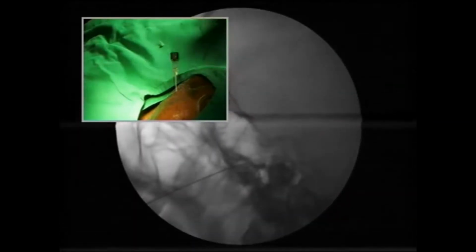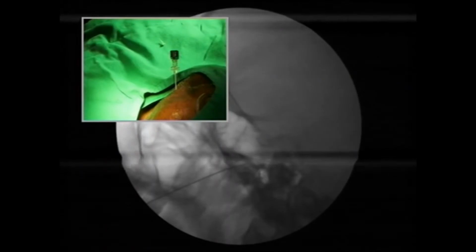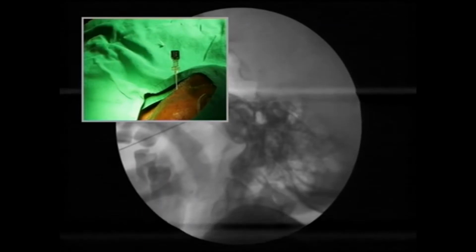Okay, can you get the C down? Okay, thoda. Okay, sure. Okay, stop. Can you give me a marker again? Okay, can you focus on the C? Please come out. Focus on the C. I want to explain the image. Yeah, explain it on the scene. Yeah. Okay, can you see this image, Pankaj?